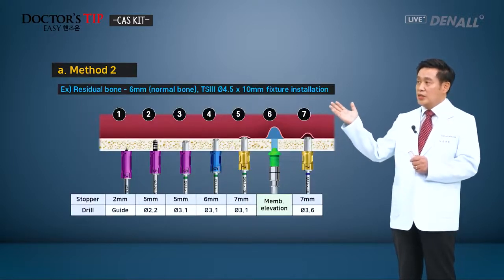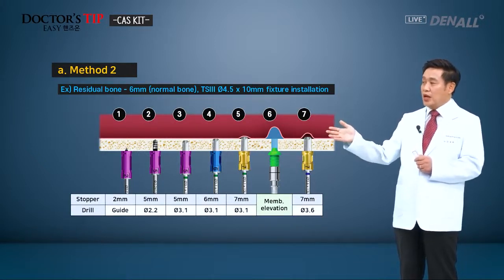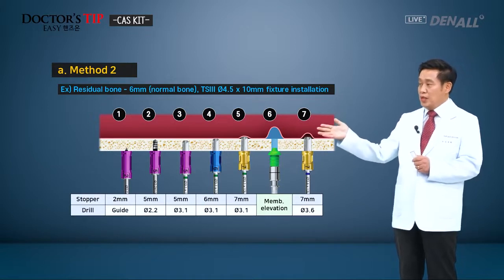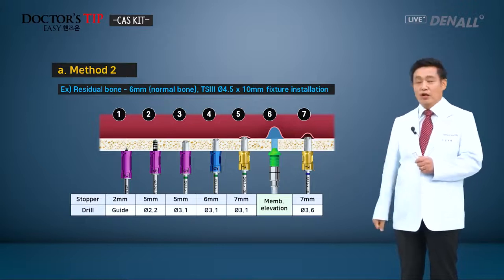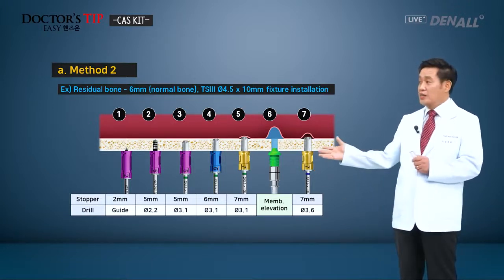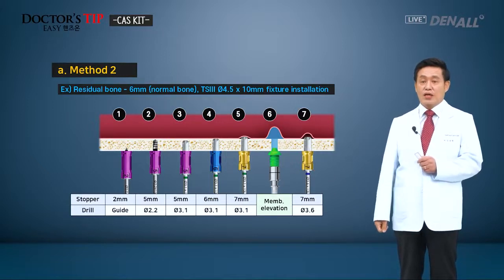The same example, 6 millimeter high normal residual bone, guide drill 2.2, 3.1 drills, and 5, 6, 7 millimeters. That is, the lengths are increased until the sinus floor is penetrated. After confirming the penetration, hydraulic lift is done, and using the final drill fitting the diameter of the implant to be placed, the drill hole is widened in this method too.